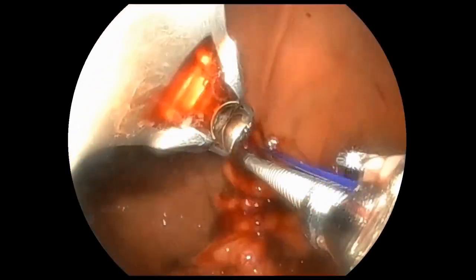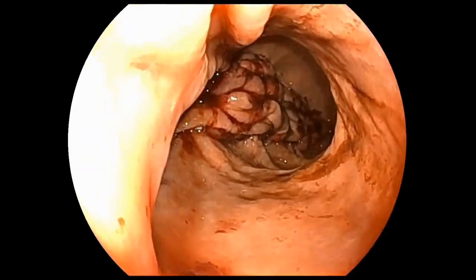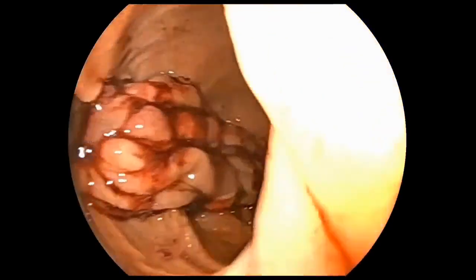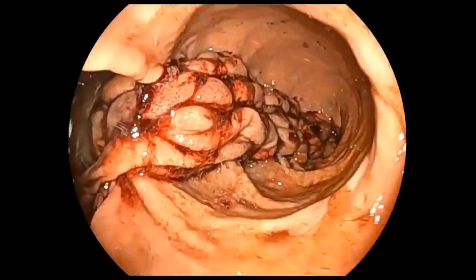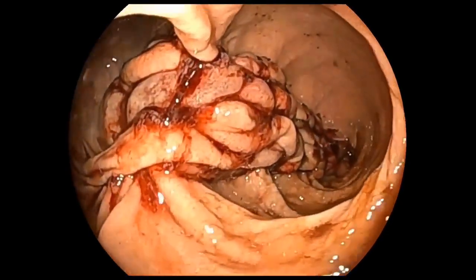The alternating U and straight pattern is then repeated to the level of the GE junction. Here we see the final sleeve construct after placement of nine total sutures over 47 minutes. A small fundus cap is left untouched. The sleeve is uniform in width, tightly sutured, and without visible gaps. The stomach caliber is significantly reduced and the overall length is foreshortened by approximately 50%.